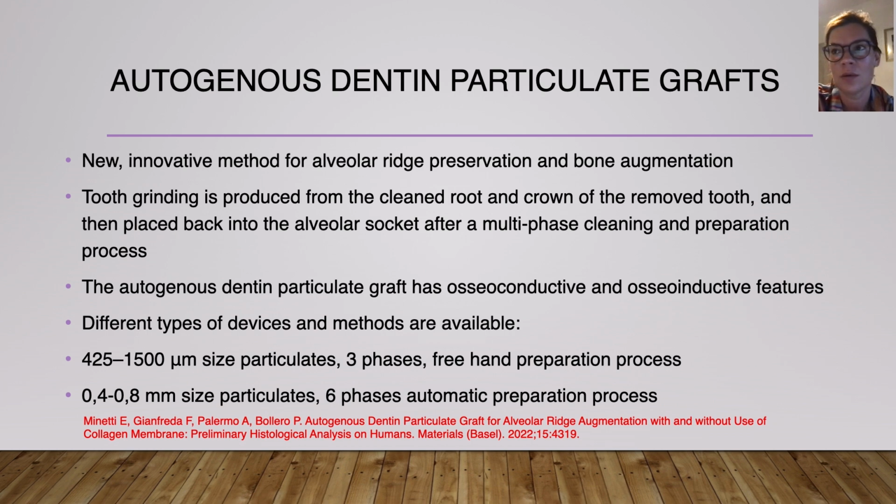For this material, we could use wisdom teeth as well, which, when they are impacted, are totally healthy with the living pulp. But we could also use teeth which are restored and have fillings, root canal fillings, and so on inside. But before the procedure, we have to clean off all the surfaces, remove the restorations, the fillings and root canal fillings, and if there is any cavity, we have to remove the inflamed areas.